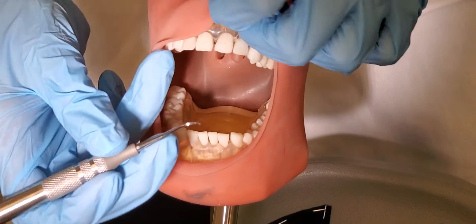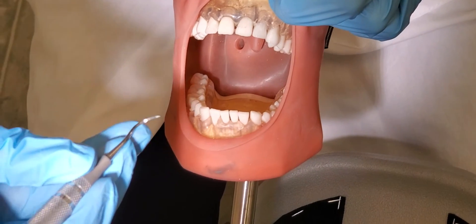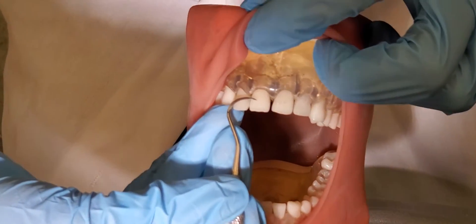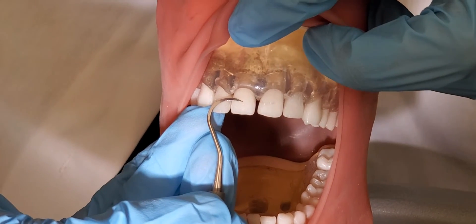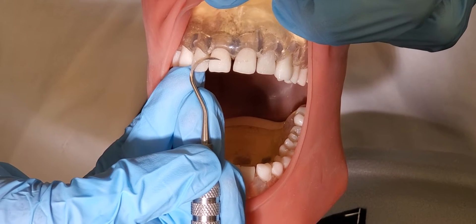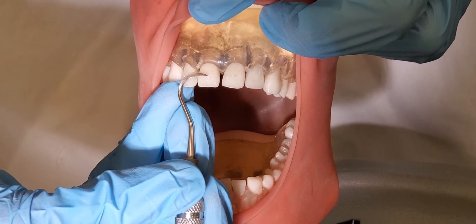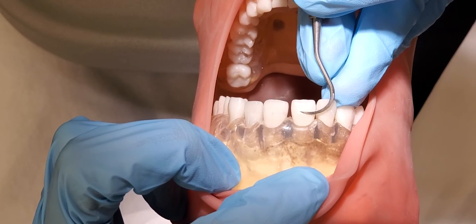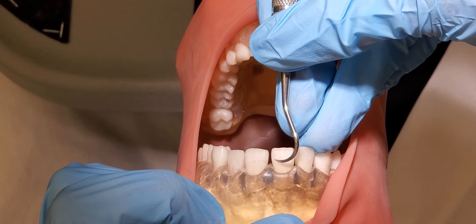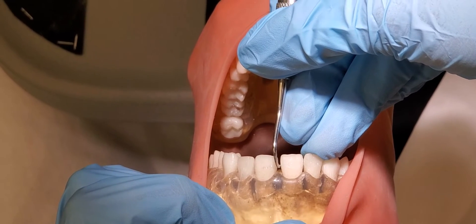Now I'm going to move to a surface away, so I've moved up to 12 o'clock. I have my modified pen grasp and I'm going to set my fulcrum down. This time I'll be on tooth number 8, starting at the midline with my tip pointed towards the away surface, making sure that I have my tip third on the tooth, not the middle third or the heel third. Now I'm just going to practice rolling and pivoting to keep that tip third on the surface as I go around.